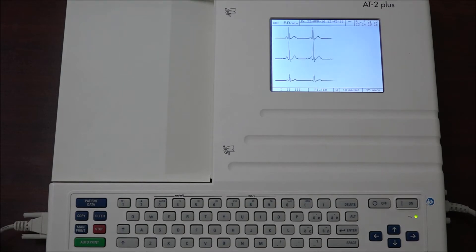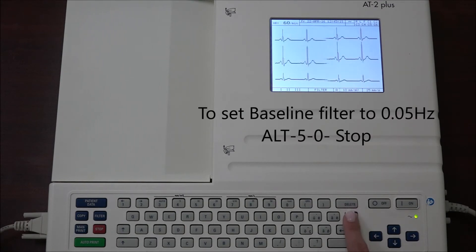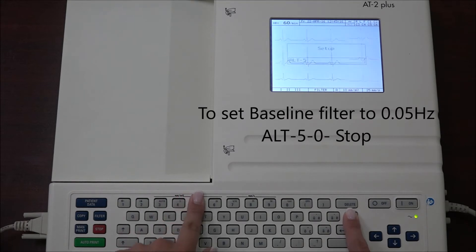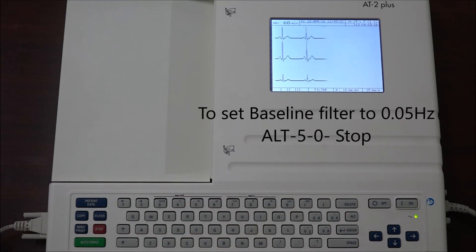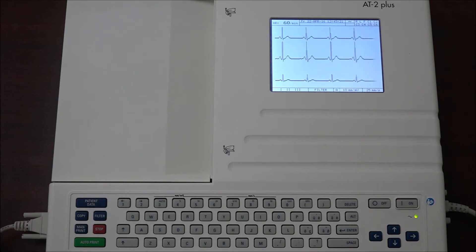In order to change the frequency for the baseline filter, use the following codes. ALT 5 0 stop to set to 0.05 Hertz. This is the default frequency for the baseline filter.